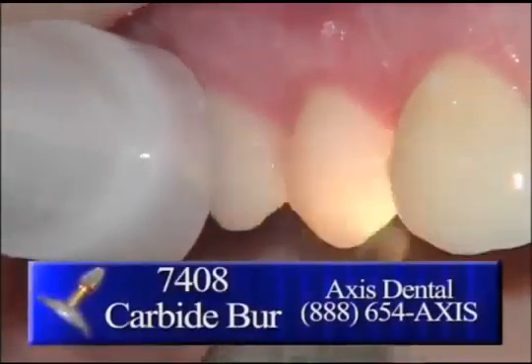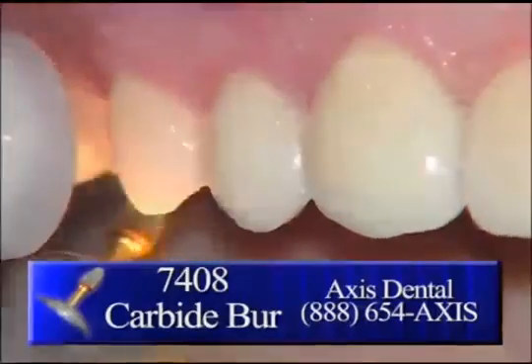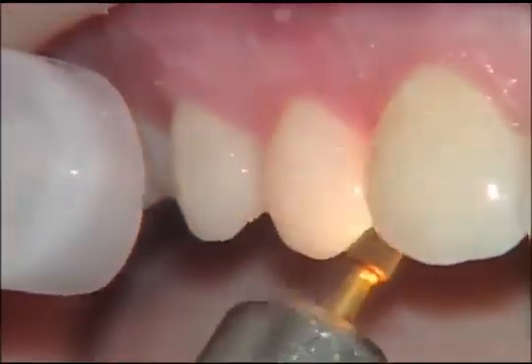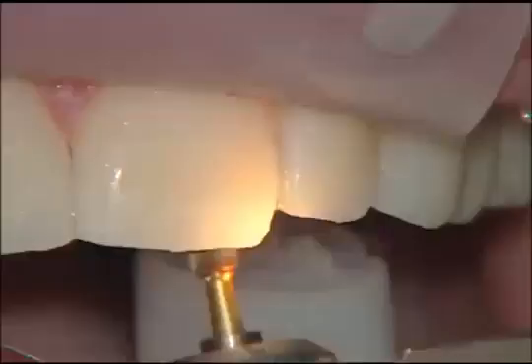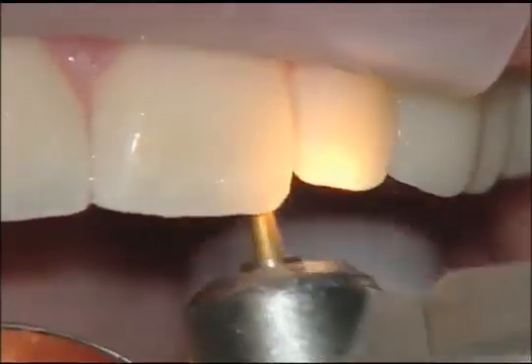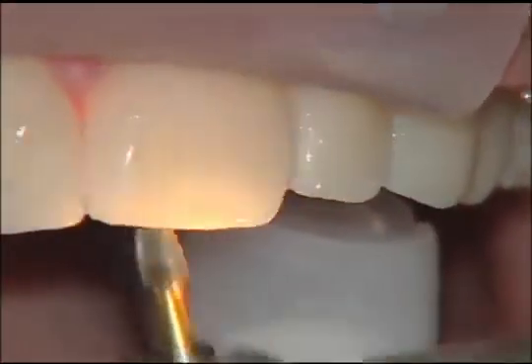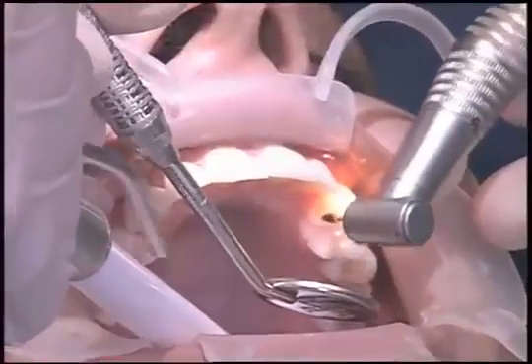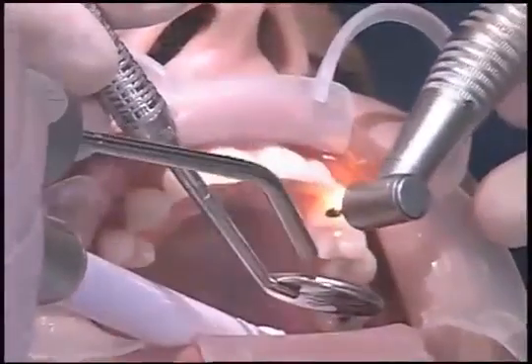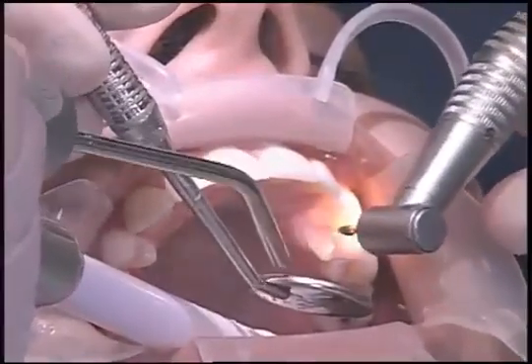Here we're using a 7408 carbide burr to go ahead and make any adjustments on the back. Typically what we're doing here is removing any excess cement at the veneer tooth juncture, and we're going in and using this to remove that, and anywhere where the ceramic might be a little thick, a little over contoured, or just a little bit rough, we're using the 7408 to smooth that off so that the patient's tongue won't be able to feel the transition between the veneer and the tooth.